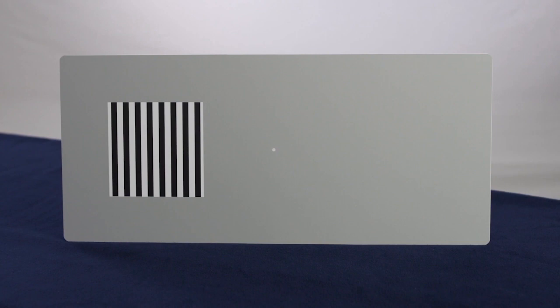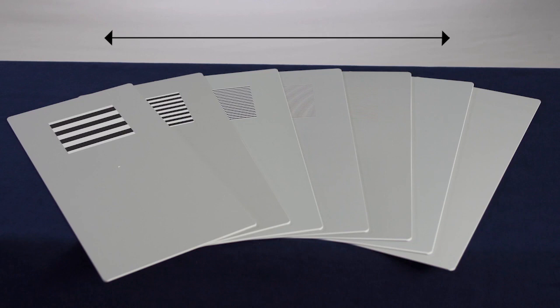Acuity cards are used to test visual acuity in young children and those with disabilities who cannot be tested with standard letter or symbol acuity tests. The stimulus on an Acuity card is a high contrast, black and white pattern of stripes called a grating. The gratings range from very coarse to very fine in order to test visual acuity from very low vision to normal.